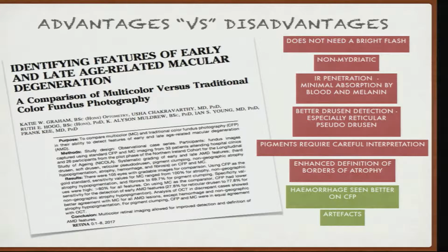Usha Chakravarthy and group in Ireland have done a lot of work on multicolor photographs, and they published multicolor versus the traditional color photograph, and they found multicolor can pick up more AMD features better than the color photograph. The main advantages being it's non-mydriatic, it doesn't need a bright flash, and there's better penetration and higher definition. Of course, there are a lot of artifacts which we are facing, and a lot of work is going on to correct the artifacts.